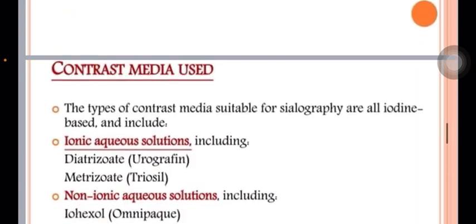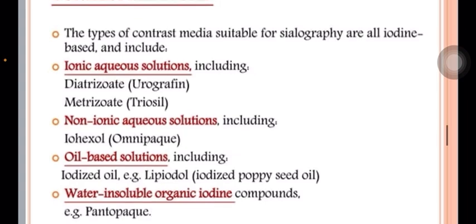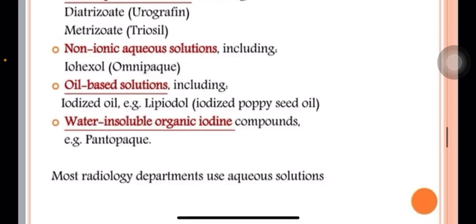Contrast media used are all iodine based. They can be ionic aqueous solution, non-ionic aqueous solution, oil based solution, or water insoluble organic iodine. In most departments aqueous solutions are used.